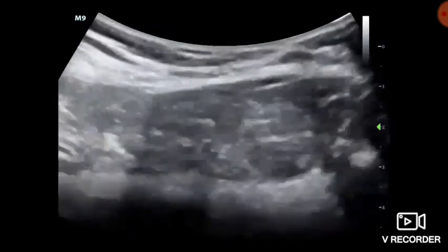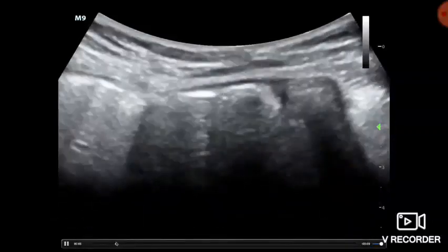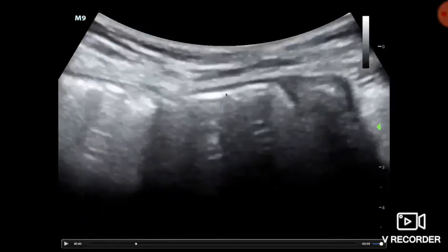Now, it's important to understand what a false positive enhanced peritoneal stripe looks like. So if we look at this right here, this is pretty bright and it's pretty close to the surface, but if you see any kind of hypoechoic layering above what you think is the peritoneum, it turns out that that is not an enhanced peritoneal stripe. This is actually air within the bowel lumen, and this is probably bowel wall right here.